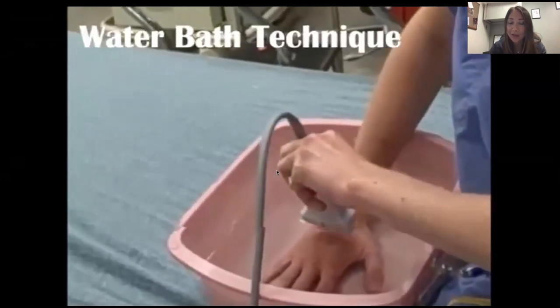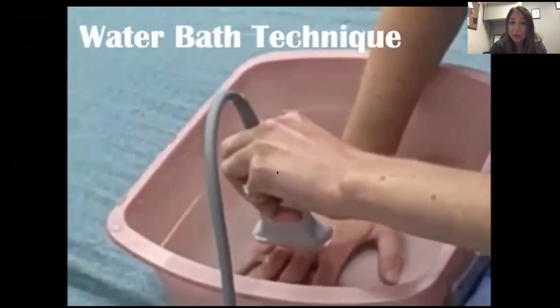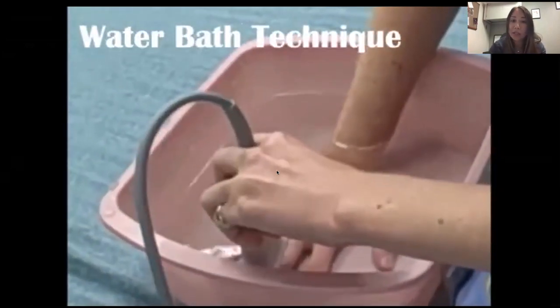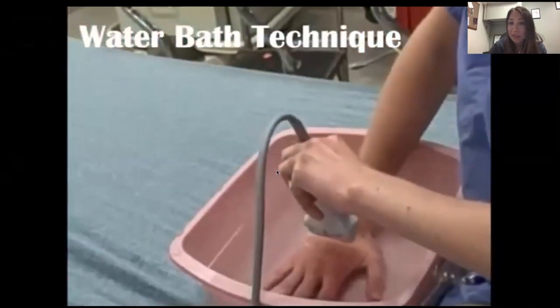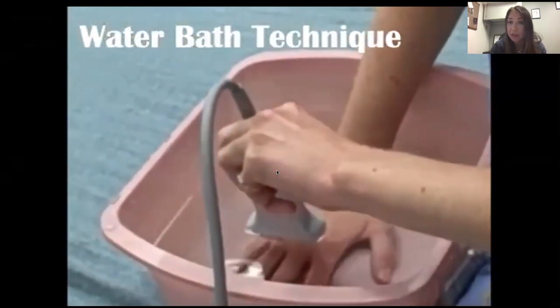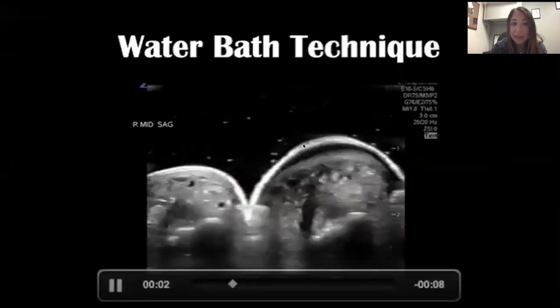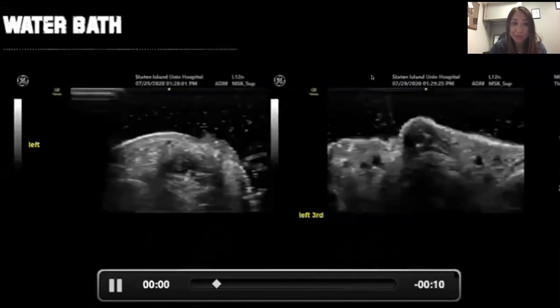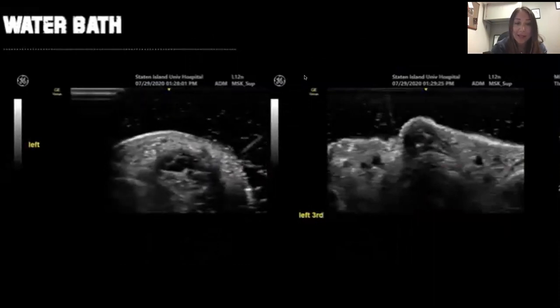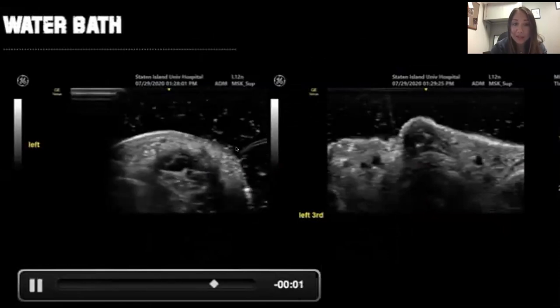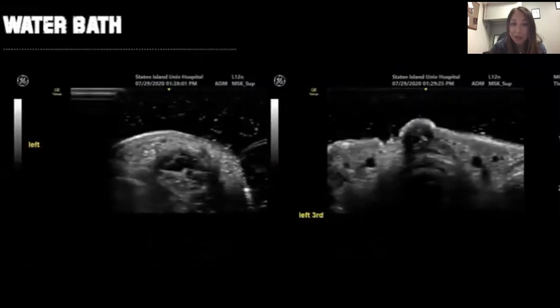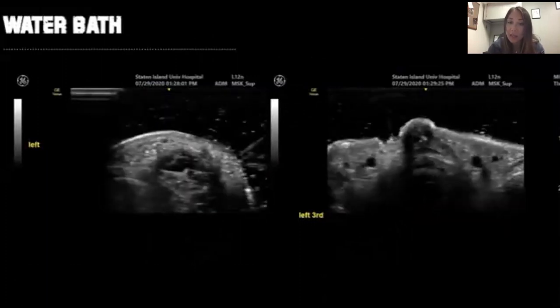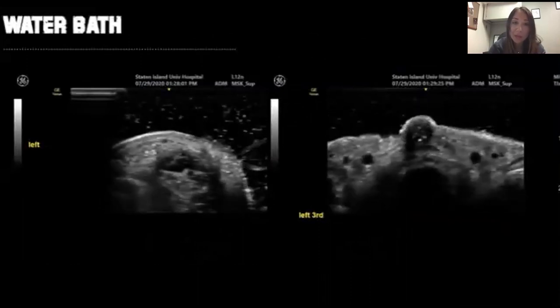Any time we look at fingers and toes, one of my favorite things to do is a water bath — you simply place the hand or toes into a basin filled with water, because ultrasound likes fluid. The water acts as an acoustic medium to enhance images instead of using large amounts of gel. Everything appears beautiful — bones are bright white and images are enhanced. We had a patient in a lot of pain and the fluid squirting from his fingers was actually blood, but he tolerated it easily because the ultrasound probe wasn't touching him — his hand was just submerged in water.